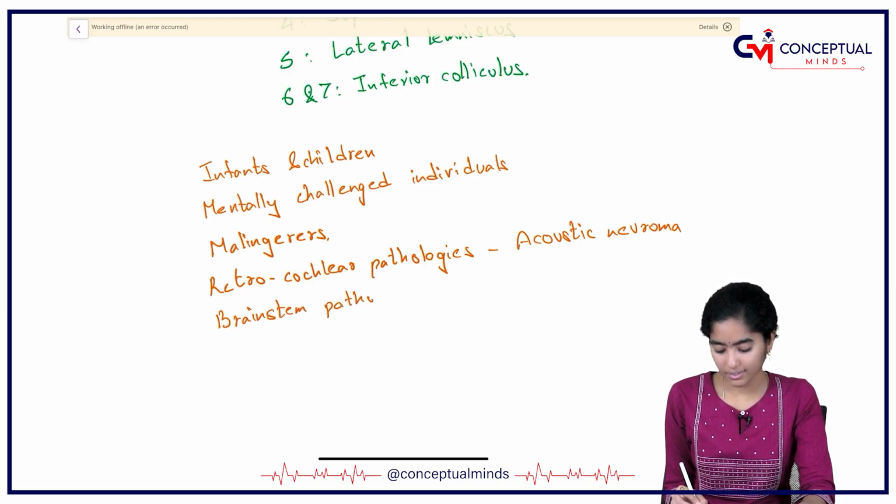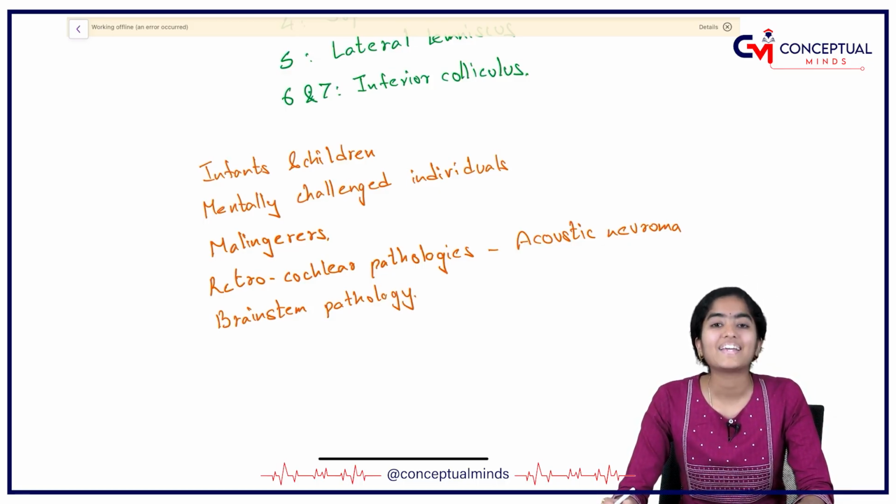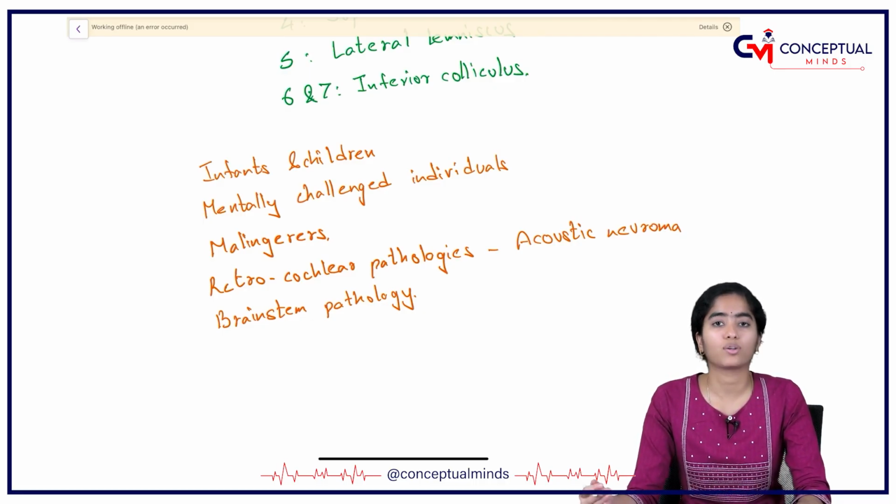Can you think of any other test that identifies brainstem pathology? Yes, it is our acoustic reflex test. The stapedial reflex can also identify any brainstem lesion.